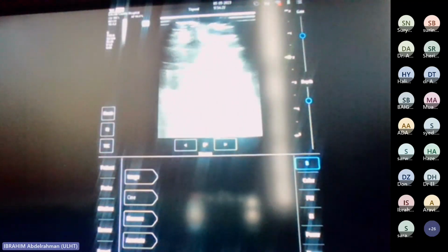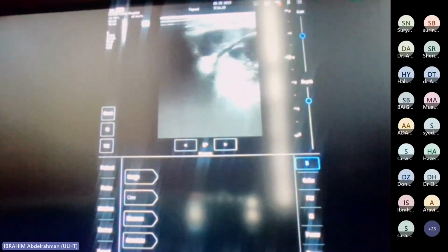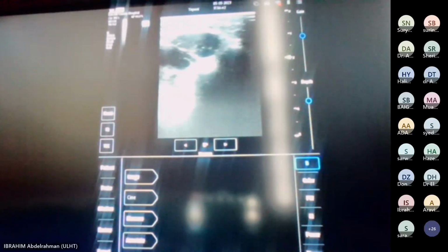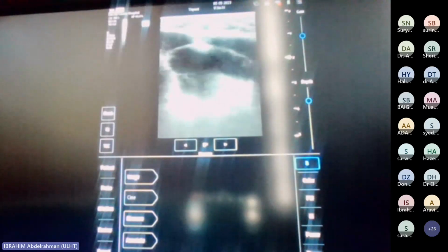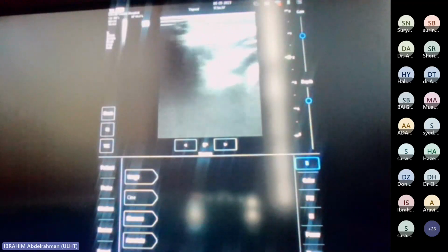you will know that quite quickly. If I move here, I expect to go to the right of the patient, and if I go from here, I expect to go to the left of the patient. If I turn my probe and go there, it's moving the wrong way. I expect it to come this way and it's going that way. So if you have a go and move that way, then move that way and then turn it round, you'll know you're coming to the right side, but actually I'm moving to the left. So keep the marker towards you or the patient's head.